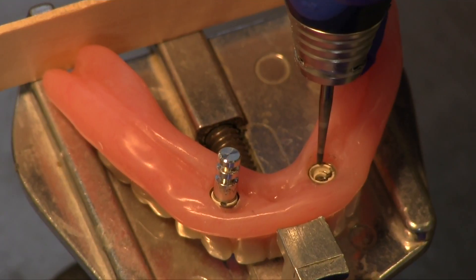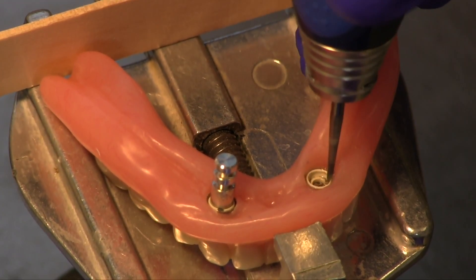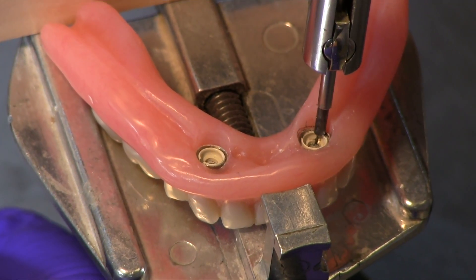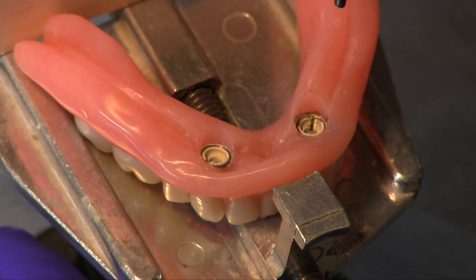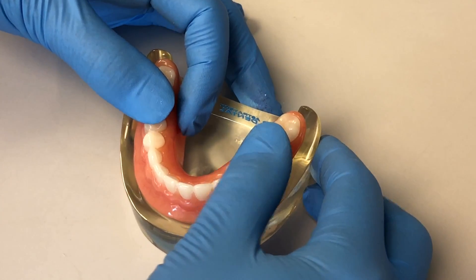Keeping the denture in the cast holder, use a flat-sided laboratory burr to trim the acrylic parallel to the path of insertion. Contour the axial surfaces to eliminate the undercut. Lastly, finish and polish any sharp angles or rough areas, disinfect, and return the prosthesis to the patient. When you are finished, the overdenture should snap into place without interference.